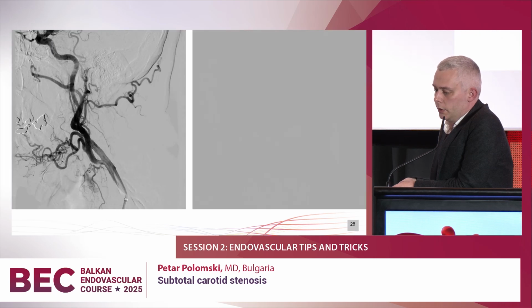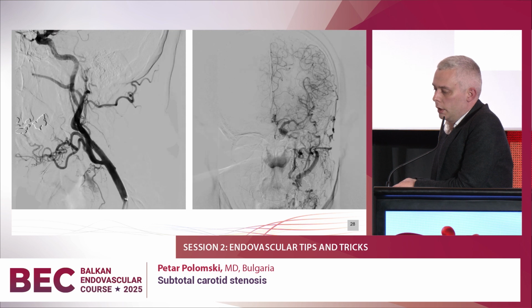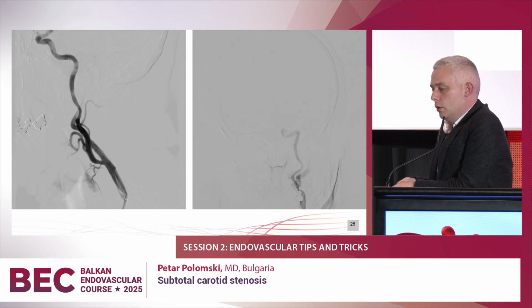And this is the result immediately after stent implantation, also intracranial.